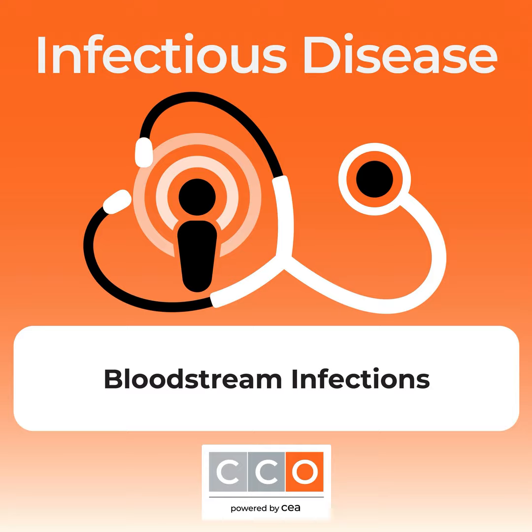So this gets to the important question of, if a tree falls in the forest and no one is around to hear it, does it make a sound? These rapid diagnostic tests provide us a wealth of information, but they're frankly not going to be as useful unless there's active intervention to implement the results. And this data comes from two big meta-analyses. The first was from 2017 and found decreased mortality and length of stay when rapid diagnostic tests were used in conjunction with an active antimicrobial stewardship program, but not in their absence.